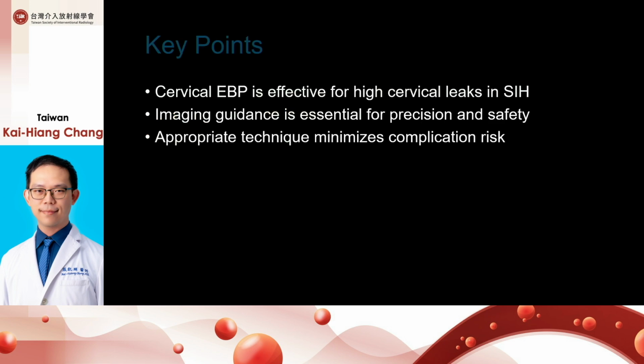So to sum up, the cervical epidural blood patch is effective for high cervical leaks in SIH, and careful image guidance is essential for precision and safety. Appropriate technique can minimize all the complications and risks.